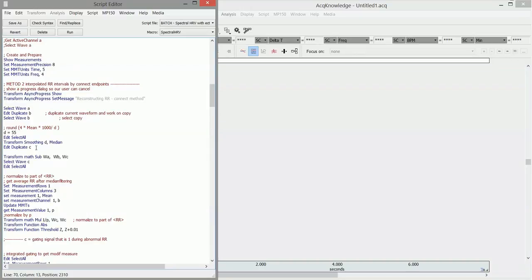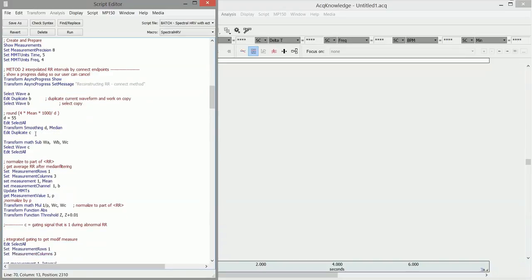You can also put in events in this analysis, but in this case, all the files in my directory are 5-minute files. I smoothen the RR file so that median filtering takes away all the spikes, and then I compare the original RR file with the smoothened one, and then you get a gating, so you can gate out all the sections of the original signal that are suspicious, so to speak. And the thresholds for doing this detection are something you choose in the code, and I've made the choices here.